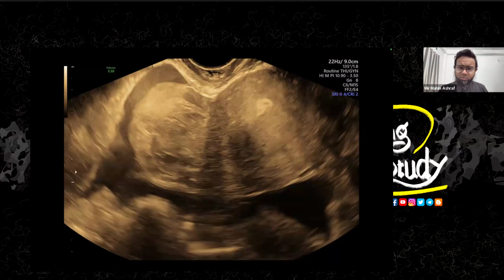When I use my regular abdominal preset, I can't see any debris within the urinary bladder, because I have changed the contrast to assess the liver lesions more beautifully. When I'm going to look for debris or urinary bladder luminal lesions, I just switch my preset to the bladder one, which I have already made, and then I can see that lesion. I've changed the contrast and the gain. That's why just changing the gain may not give you a good result.